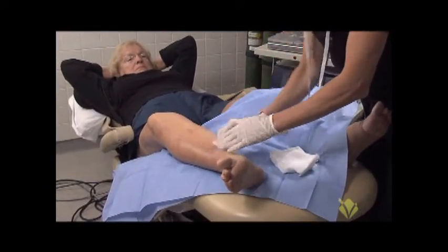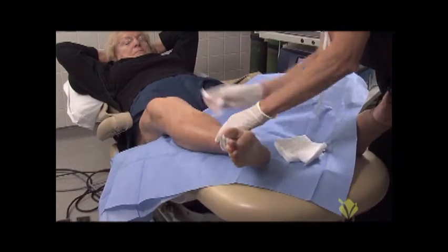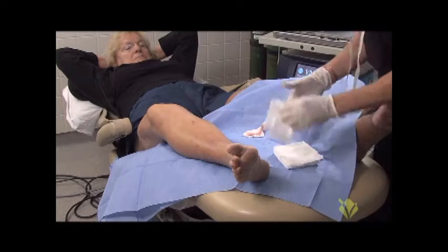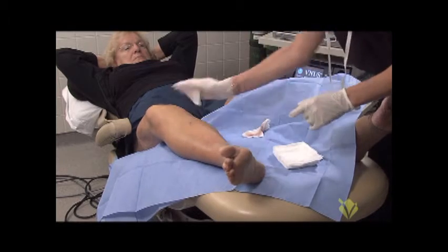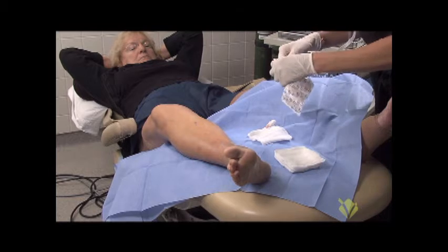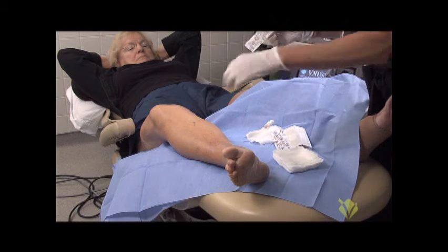A little bit of a wet gauze, and then dry it — the insertion site — and go ahead and put a band-aid over the insertion site.